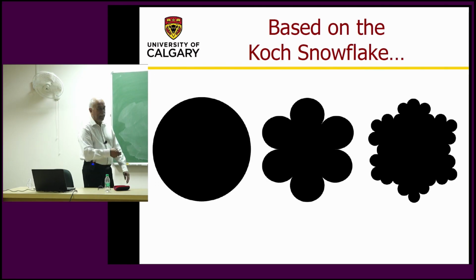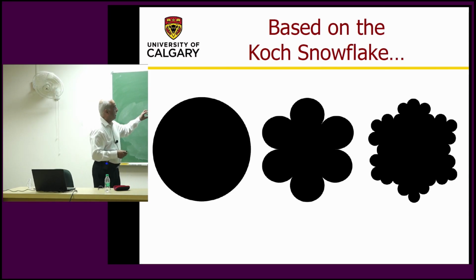The first stage is 3, then 6. And take each of these and make smaller circles and stick on there. The placement rule is the same as to how these are placed. So on these, now I put 3 more circles and so on. So again, there are some inaccuracies due to the discrete grid. So we could call this a benign mass.